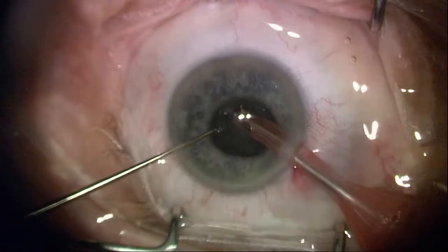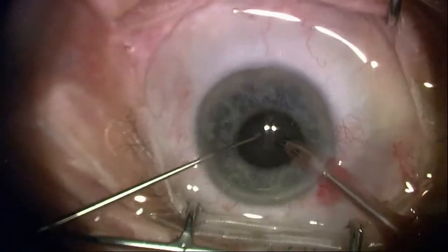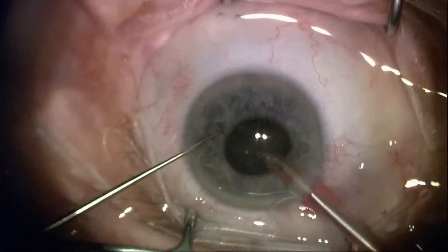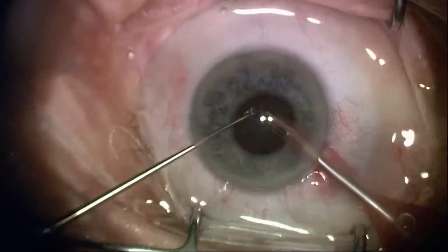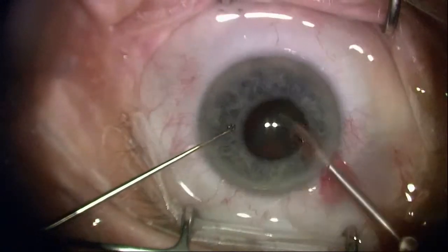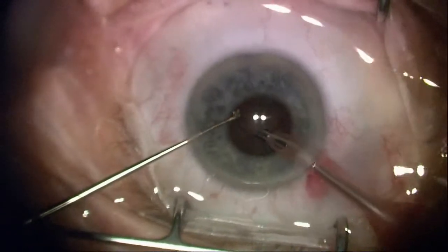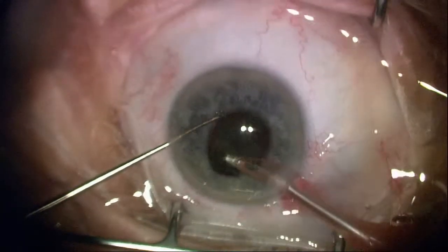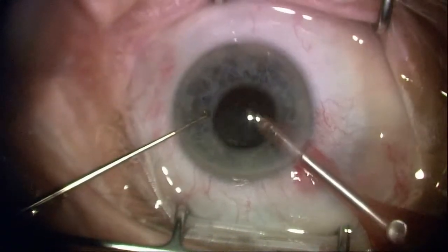I'll switch now to a quadrant removal setting on phacoemulsification. Again, maximum occlusion so that I don't have a lot of turbulence and risk aspirating the iris or injuring the iris or the sphincter. I'm staying in a very safe zone, moving the tissue around and maintaining occlusion with nucleus and epinucleus, doing very slow-motion-type phacoemulsification at also low flow — just taking apart the nucleus and trying not to injure the iris.